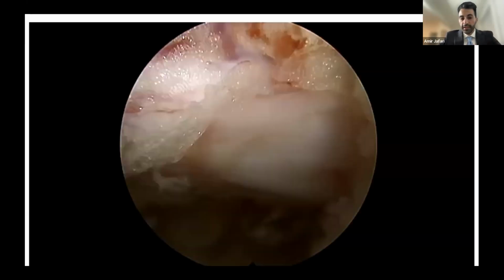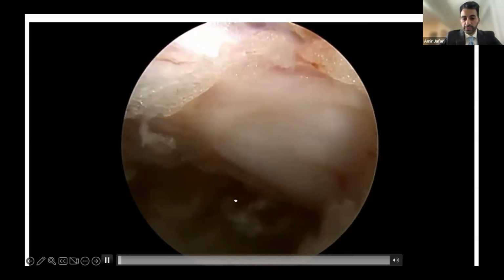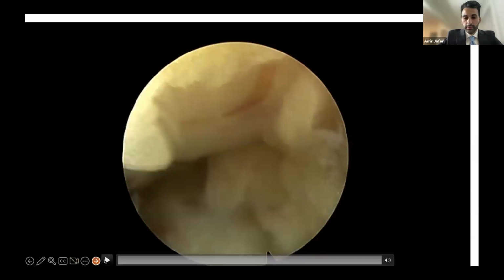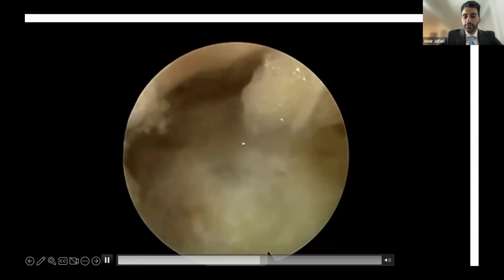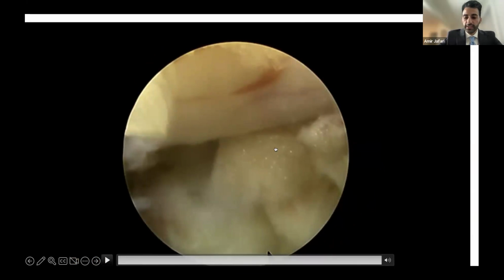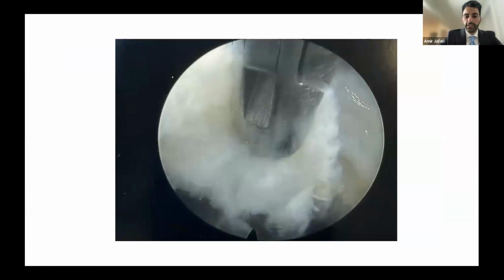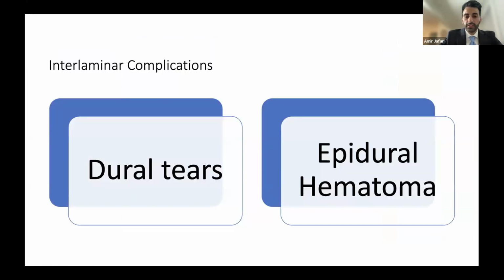And this is what the nerve looks like after it's been freed up. You can see that underneath it, there's a shadow. And the nerve is free. Another example. And this is when you want to look at what's the end goal. The end goal is to see this pulsatile flow. The nerve is not adhered anymore, it's free, and there's a pulsatile flow. Another example of the nerve. This is an example of a disc. Disc coming out, being pulled out, a fragment of the disc.